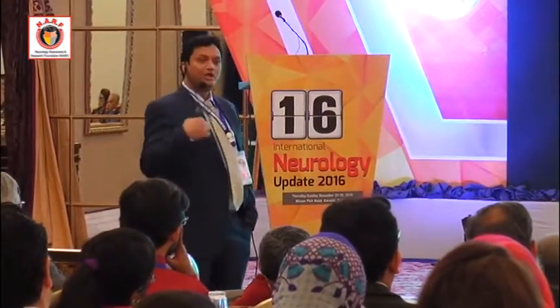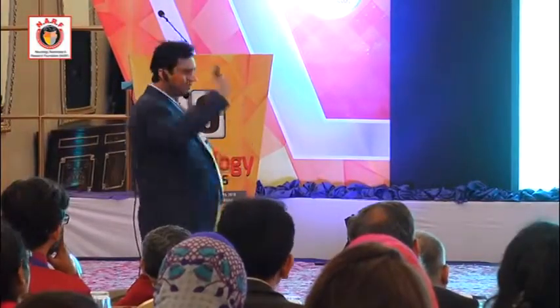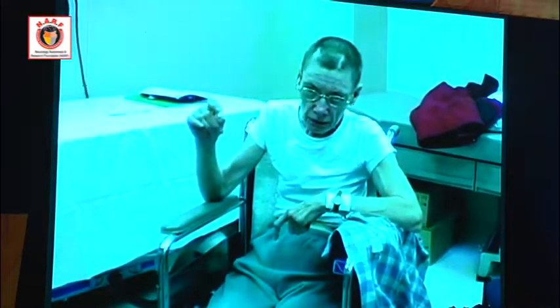And then we will turn on the DBS. And as the DBS turns on, all the tremors stop. Patient's posture improves. Patient is sitting more upright, is able to communicate. You can actually see the markings of the scar of the DBS on the top of her head and skull, and she's able to be more effective. She's still not perfect. This is not a cure, but she's far more socially able to interact and has better quality of life.